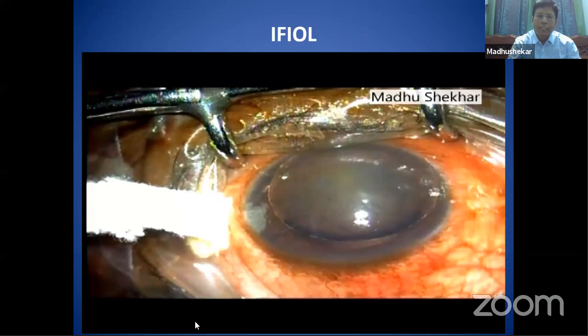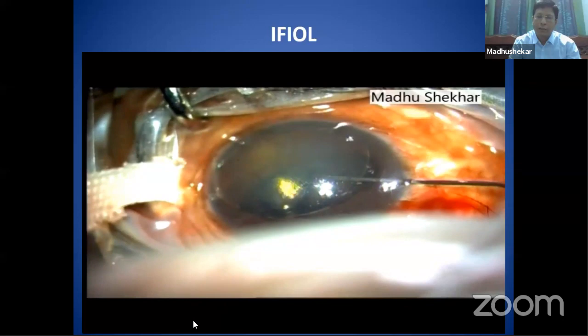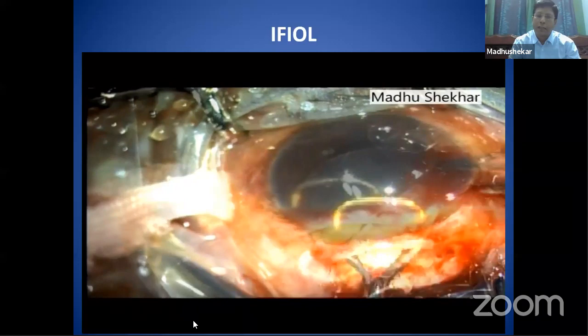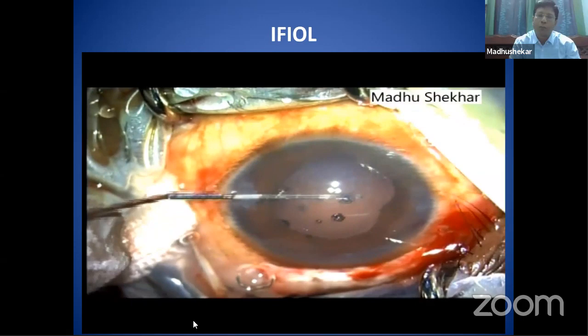Sometimes in gross subluxation, or like in this case, it is an anteriorly dislocated lens. So I am going to do cataract extraction with iris fixation of the IOL. After making a good tunnel, you can put a higher viscosity viscoelastic below the nucleus so that it doesn't drop, and then extract the nucleus. Then you have to do a good vitrectomy, anterior automated vitrectomy, bimanual vitrectomy, in the pupillary area and just behind the iris. This was a traumatic cataract and there was traumatic mydriasis, so the pupil was dilated. So I am constricting the pupil mechanically.